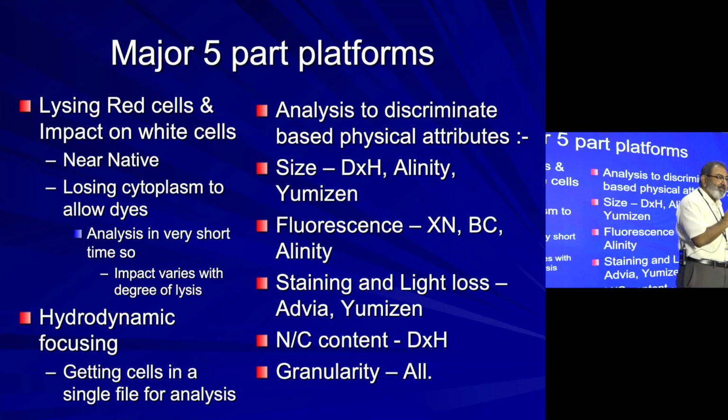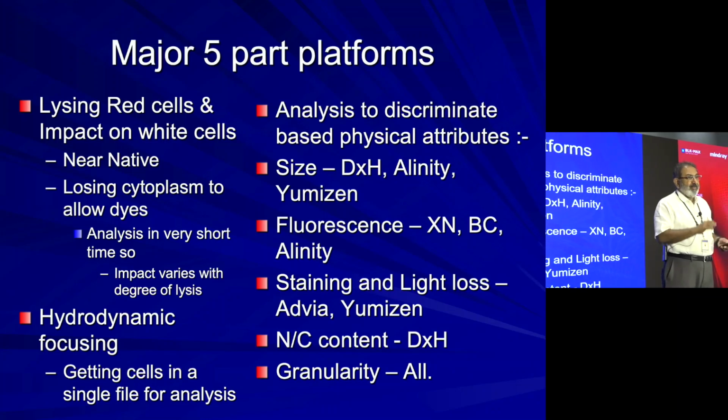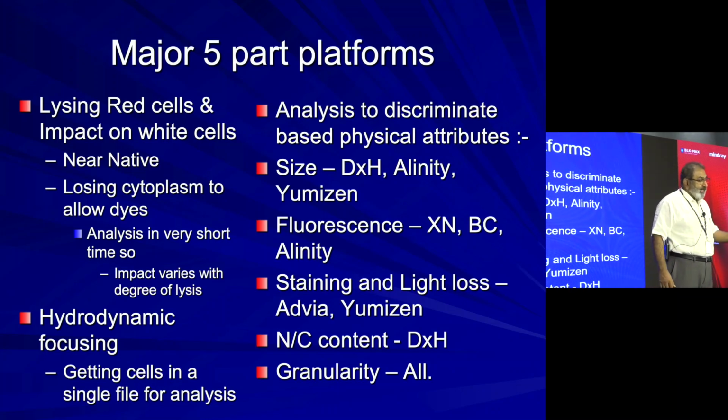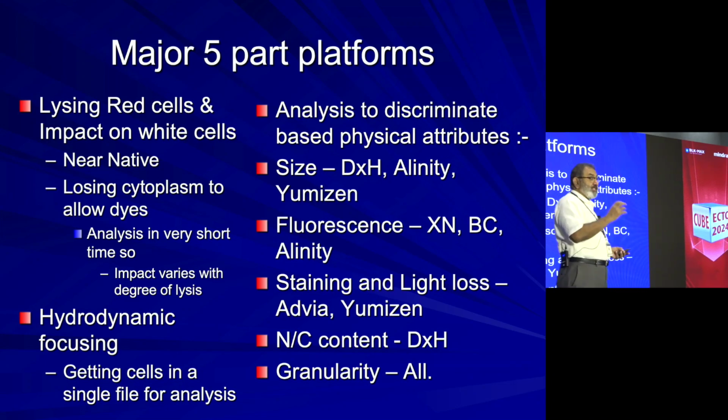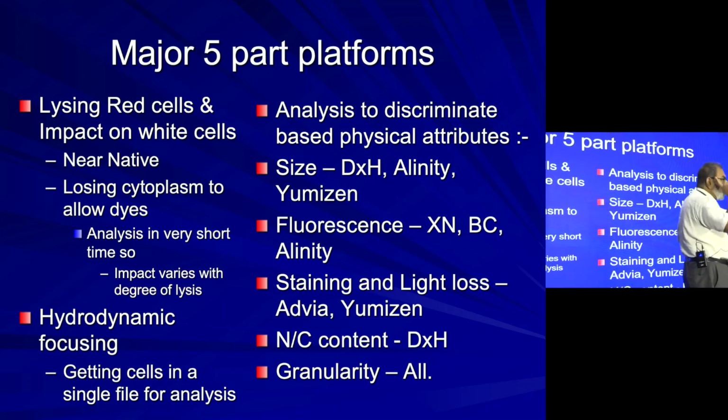So what I do is, whenever a new cell counter comes, I put the slide and one cover slip on my microscope. From this side I inject the blood, and from this side I put the reagent for the cell counter. And I want to see what is the process that's happening. You must realize one thing.